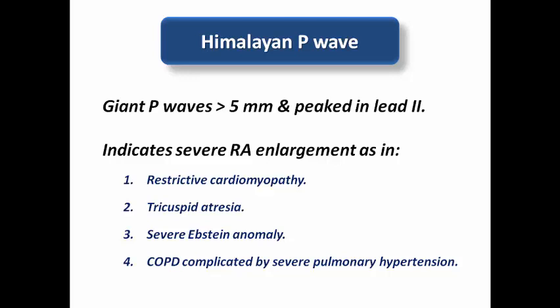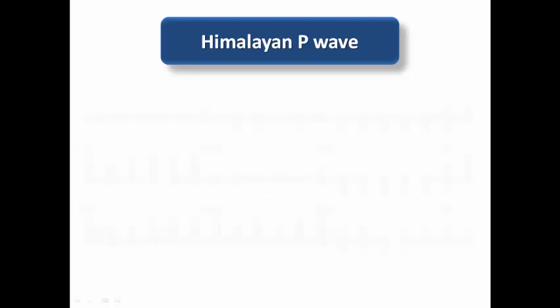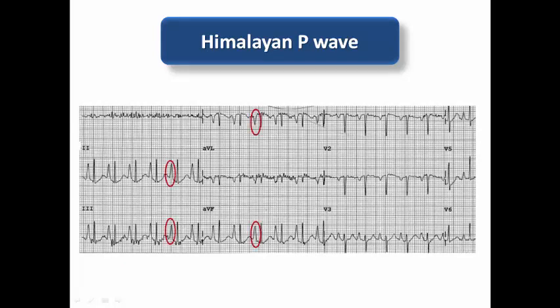In this ECG example, very giant P waves compete with the QRS complex amplitude — these are caused by severe right atrial enlargement. In AVR, the depth of the negative P wave also exceeds 5 mm. These findings signify Himalayan P waves. Echocardiography should be ordered to assess the right side of the heart and determine whether the cause is congenital — such as Ebstein anomaly or tricuspid atresia — or acquired, like pulmonary hypertension or restrictive cardiomyopathy.